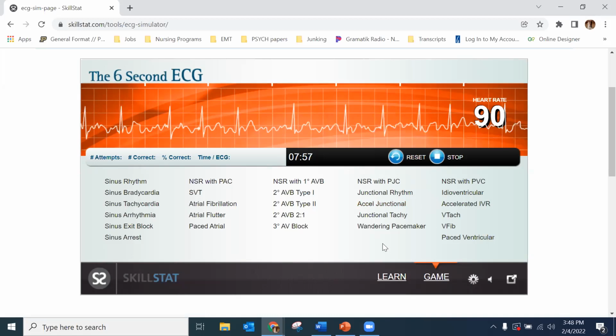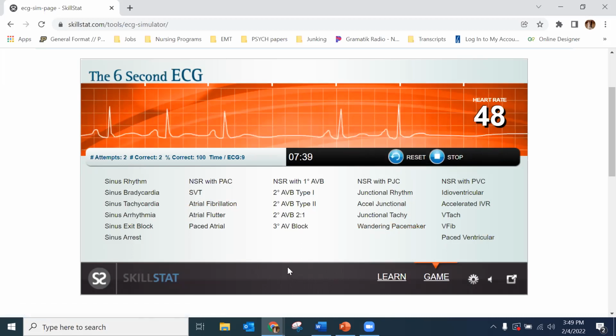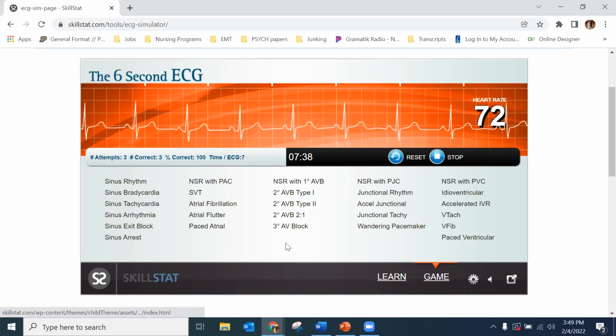What about this one? A flutter. All right. A fib. Yeah, this is honestly a nice looking fib. And I can see why you might think it's a flutter, but yeah, this is AFib. Usually your fibrillation waves for AFib are more jagged and gross looking. We're gonna skip that one. Sorry, there's some that you definitely don't need to know.